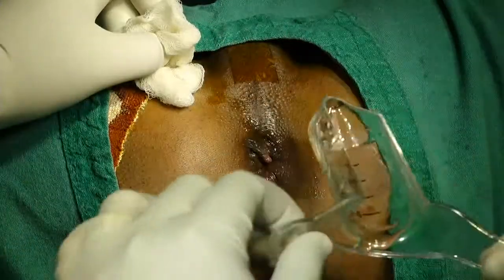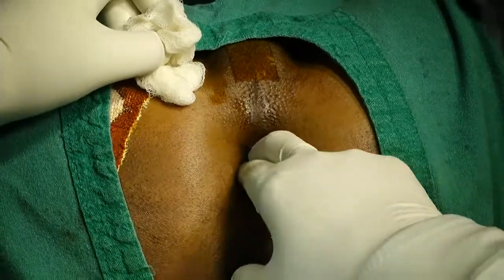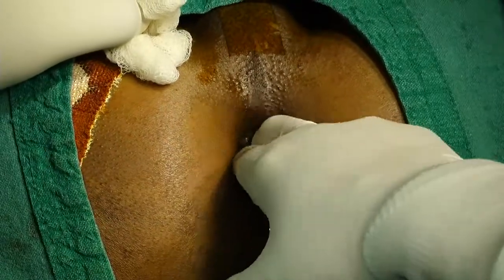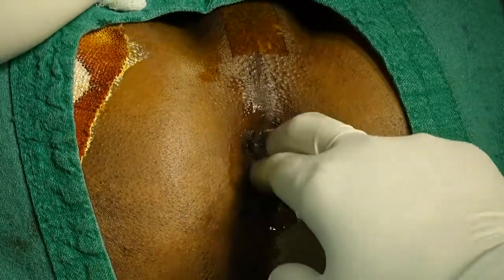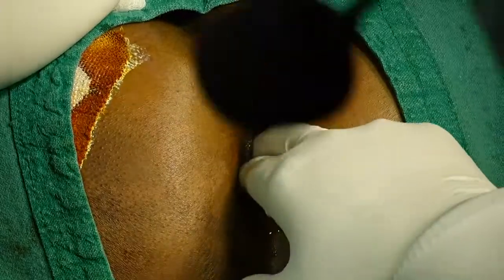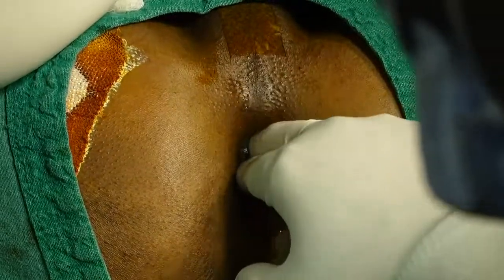It will bite the endoscope and make a tear in the anal canal with bleeding, so that is not a good job. So first single finger dilatation, then two finger dilatations. This has a tag at 11 o'clock, three degree piles, and as per the history and the previous proctoscopy, I'll show in that endoscope, the camera endoscope. We will use the camera endoscope for that.